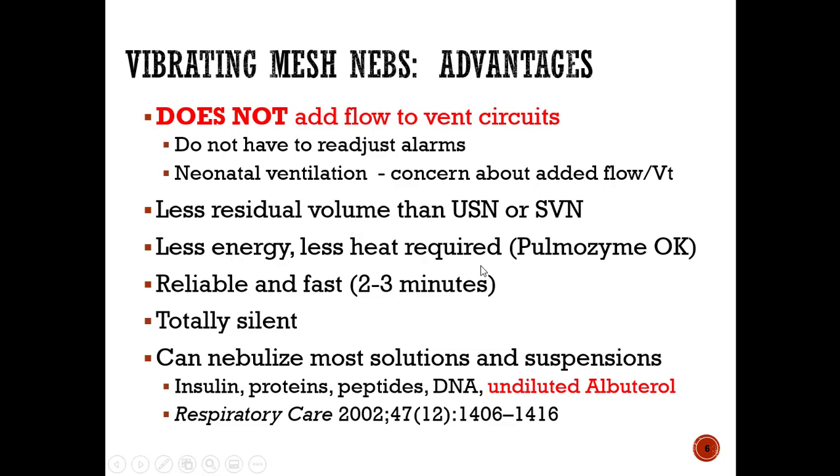Less energy, less heat required, so Pulmozyme is okay. So this is something that links to the ultrasonic neb. This is not really one that you need to know, just realizing that it can be used for a lot of different medications. It's not limited by heat. That's kind of the big takeaway there. It's reliable and fast. It lasts maybe 2 to 3 minutes and the whole thing is delivered, so pretty cool that way. It's completely silent.